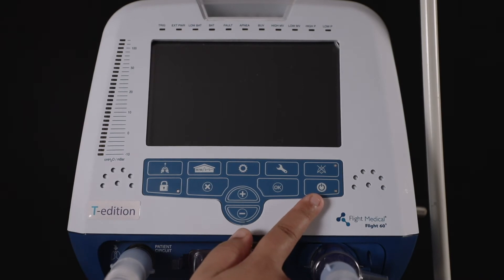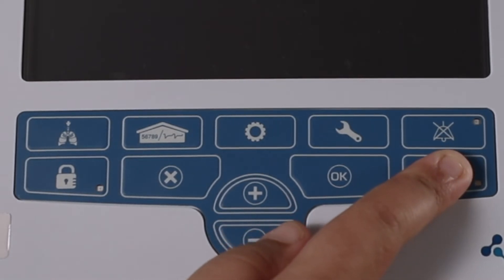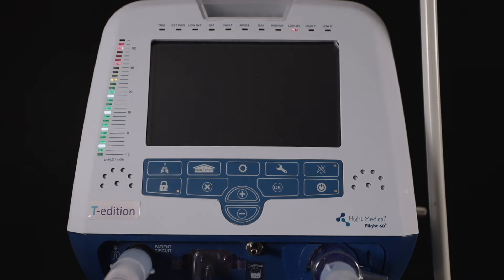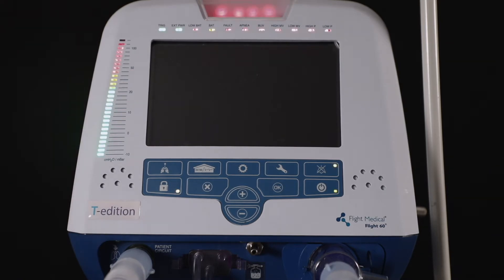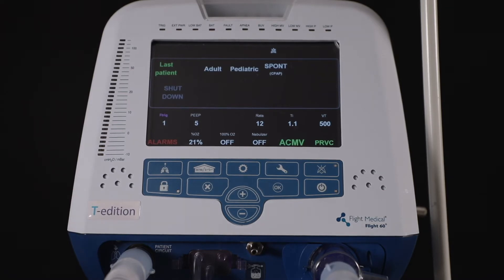To switch on the ventilator, press the on/off key for two seconds. The intelligent ventilator does a quick internal check for a few seconds before switching on. Once the Flight 60 ventilator is on, the user will see a green light appear for a few seconds on the power button, indicating the ventilator is switched on and the screen will now turn on.